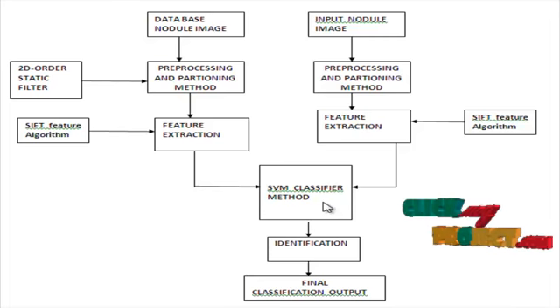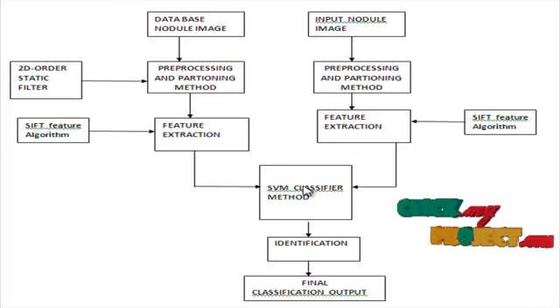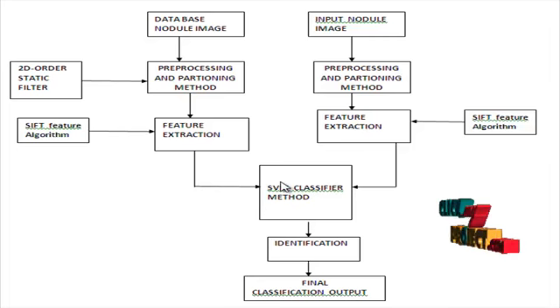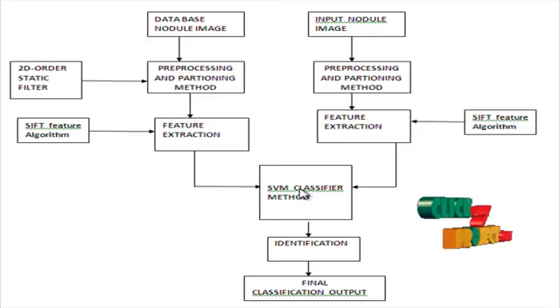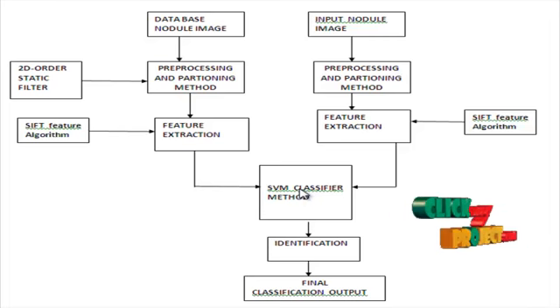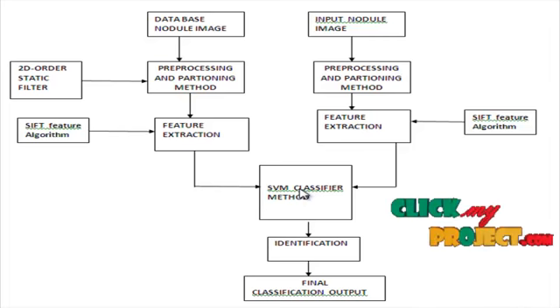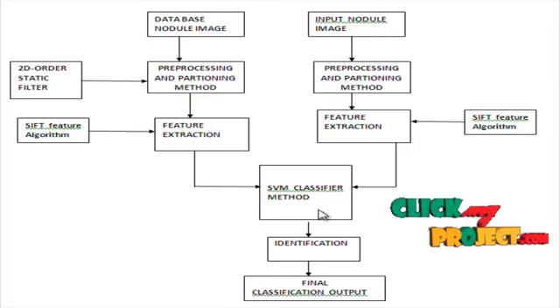The proposed classifier categorizes the lung image based on the concentric level partitioning and the extracted features. The level nodule probability and level context probability are combined to classify the image. To evaluate the design, we do a classifier comparison: our method, the SVM classifier on labeled nodules, and the SVM classifier with context analysis. The overall classification rate is also measured, along with recall and precision, for each accuracy type.